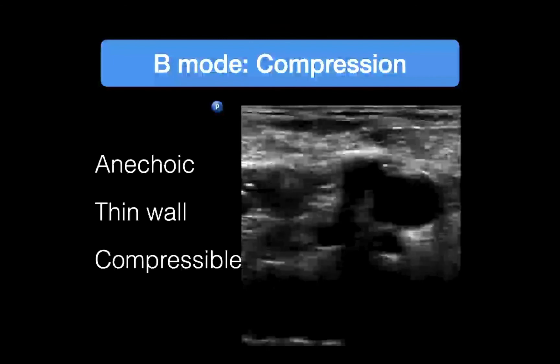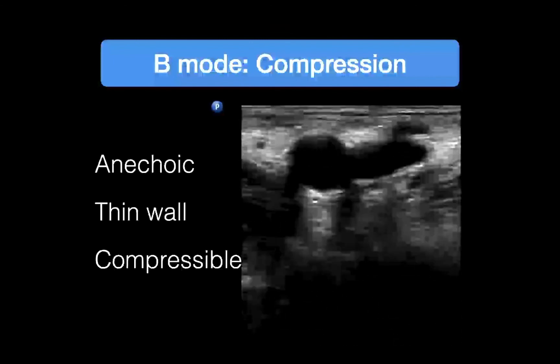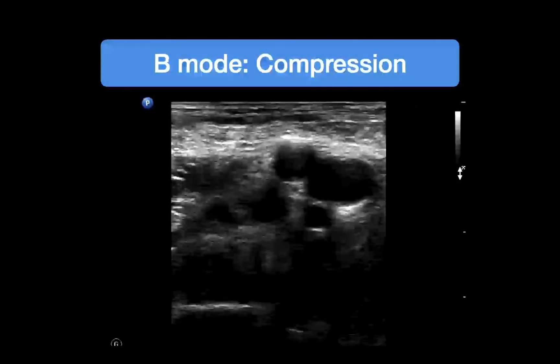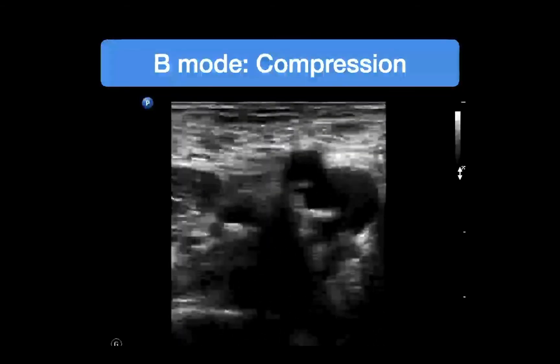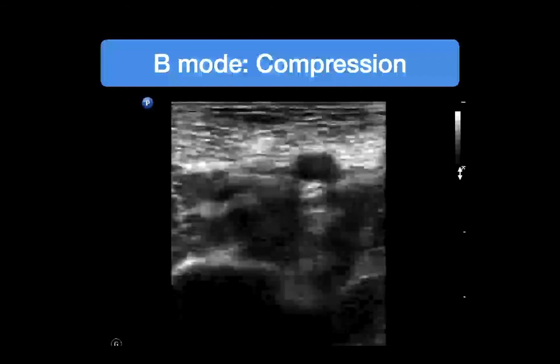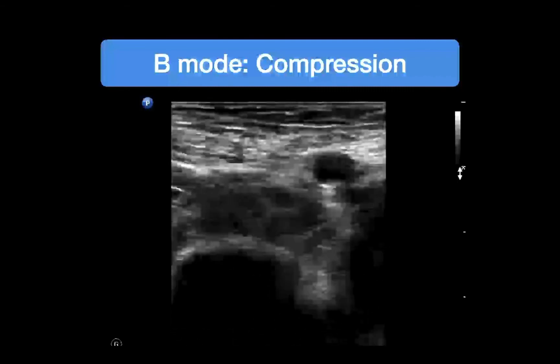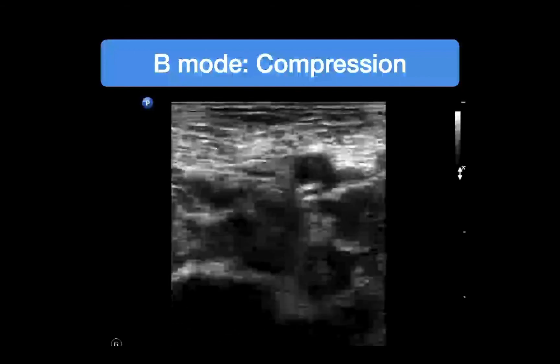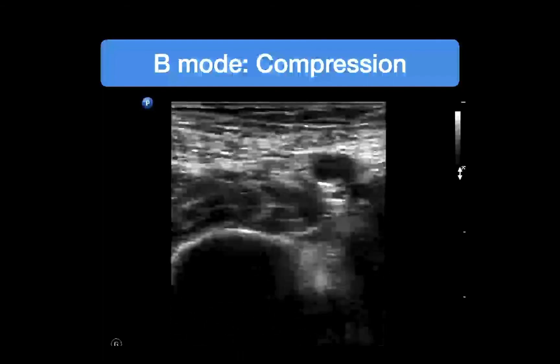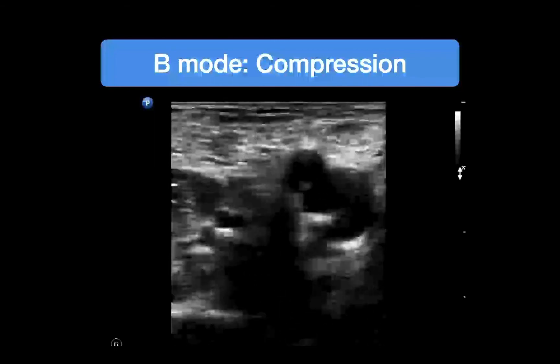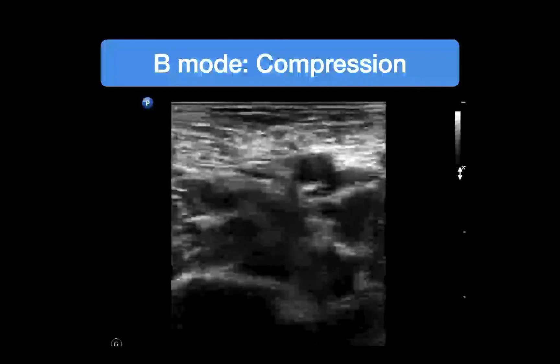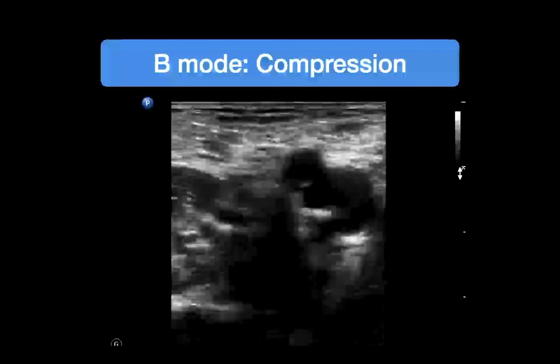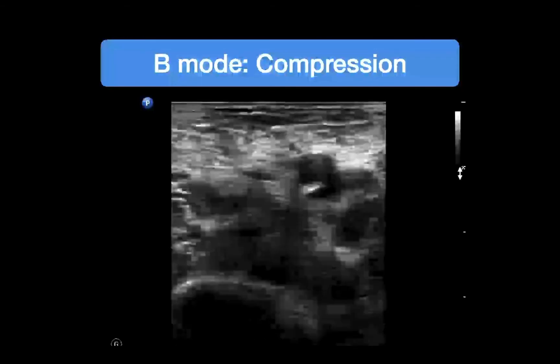When you compress the vein by pressing with the probe, you should see complete coaptation of the vein walls — it should completely collapse and be obliterated with pressure. In patients with thicker thighs, you may need to place your other hand posteriorly and compress the vein between the probe and your hand. Complete collapse confirms no DVT at that point, though it doesn't tell you anything about elsewhere in the system — you still need to look throughout.